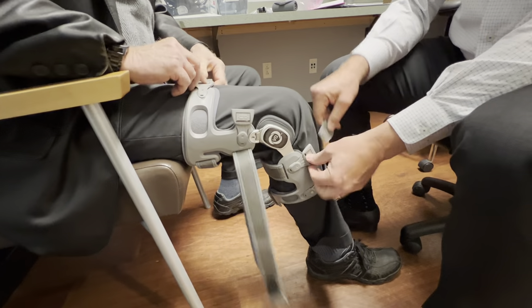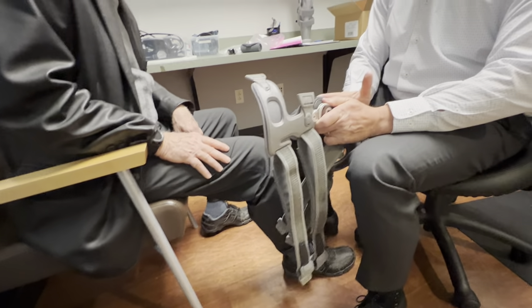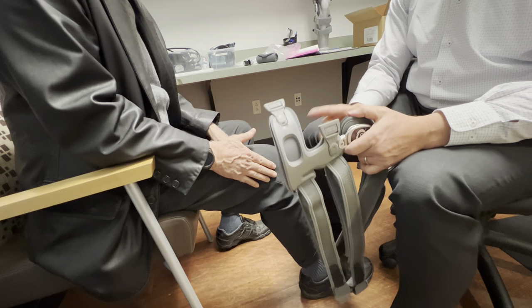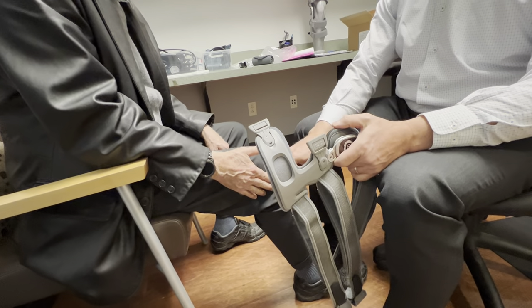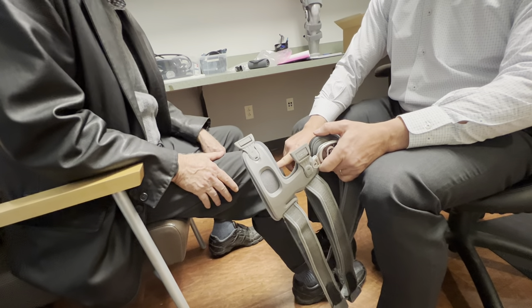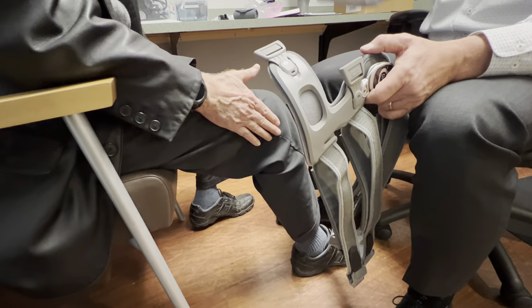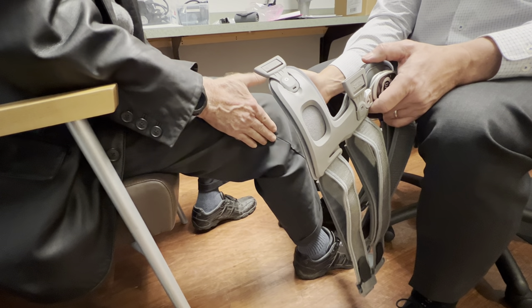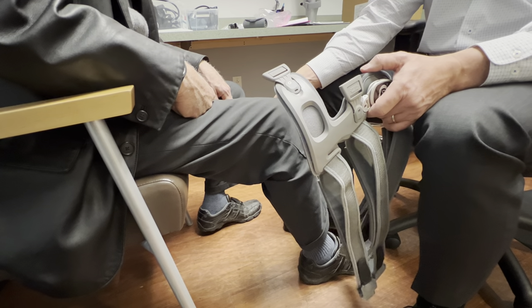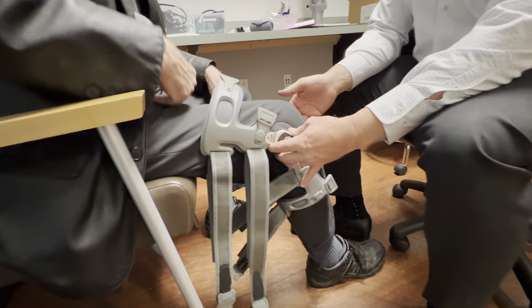We'll get all four of them off. The most important thing when putting the brace on is where you apply the pad. The biggest mistake people make is putting it on too low on their knee and not far enough on the side. A lot of times they'll put it up by the kneecap — we don't want it there. We want it on the side of the knee so it puts pressure straight across the joint to unload the knee, putting pressure on the lateral part of the joint to open up the medial part.